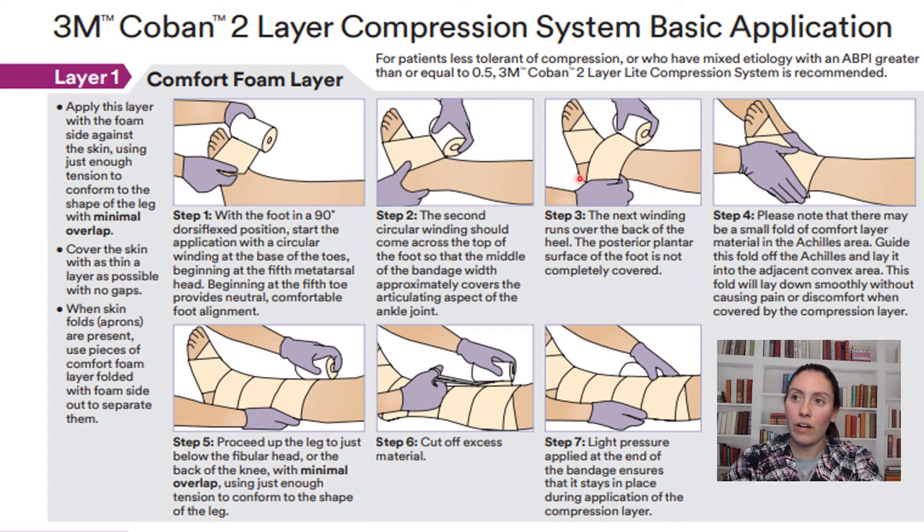Around the back of the heel, you are not going to cover the heel completely. You go around the back where the foot meets the ground and behind the ankle, but do not go directly underneath the heel with the foam. Then wrap it up the leg, and once you get to the top, cut off any excess material. The foam should stop two fingers behind the knee. Press lightly so the foam sticks together, then begin the next wrap.